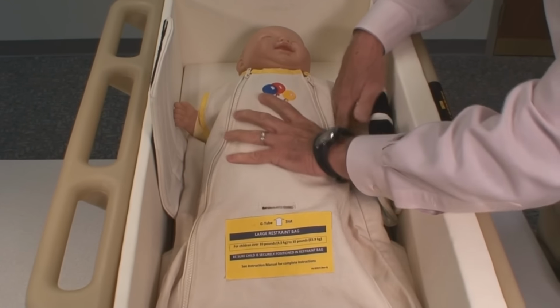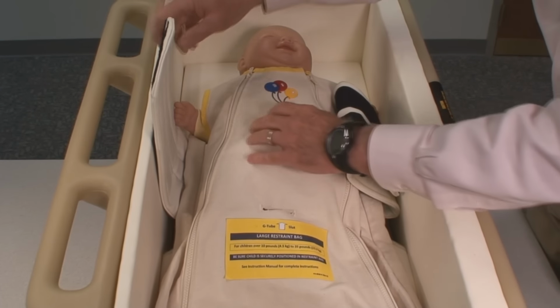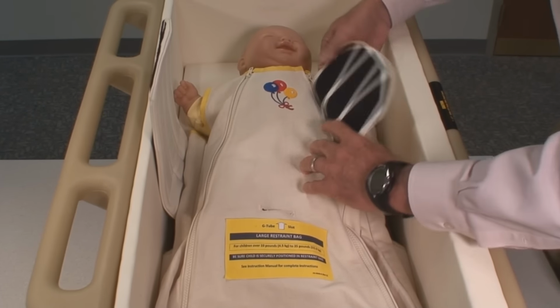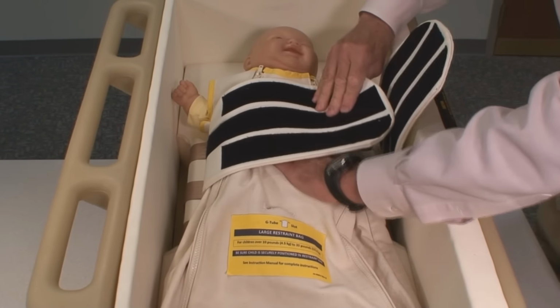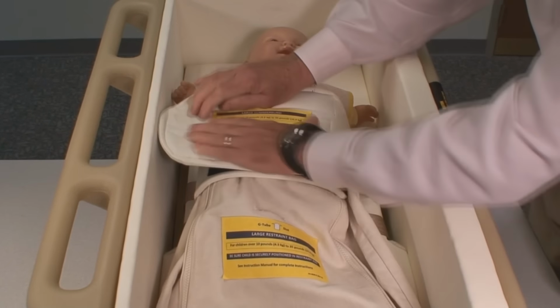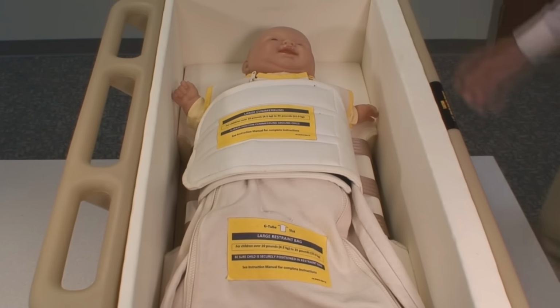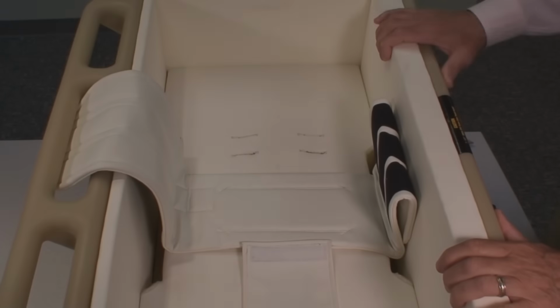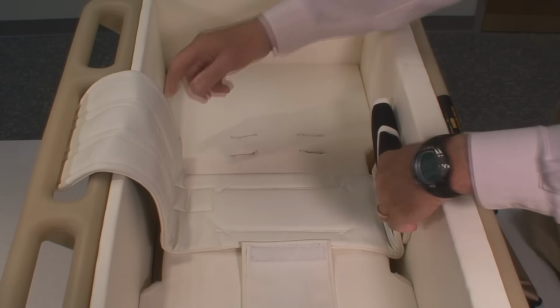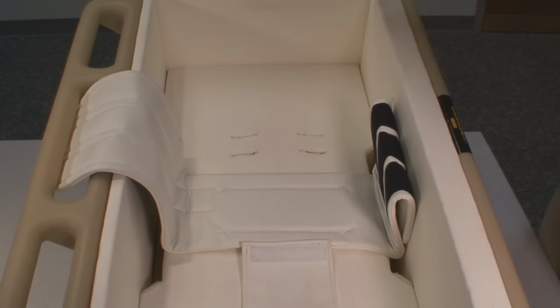Making sure the child is securely positioned in the restraint bag. Put the cummerbund over the child and secure in place. We now have the cummerbund installed in place, and we're now ready to install the 3-point harness.